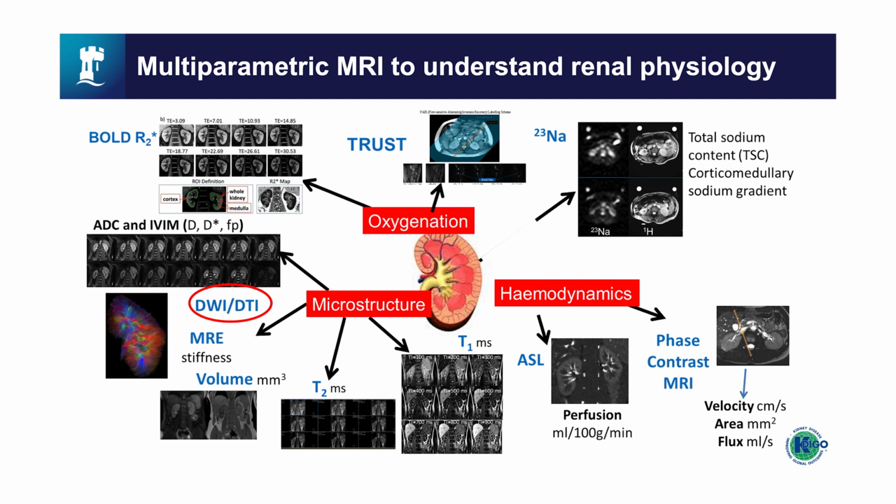So diffusion MRI tries to quantify the Brownian motion of water molecules in a volume of tissue. And it does that because pathological processes can restrict that motion. So fibrosis restricts the movement of water molecules. And diffusion imaging quantifies that restriction in a variable called the apparent diffusion coefficient, or ADC.